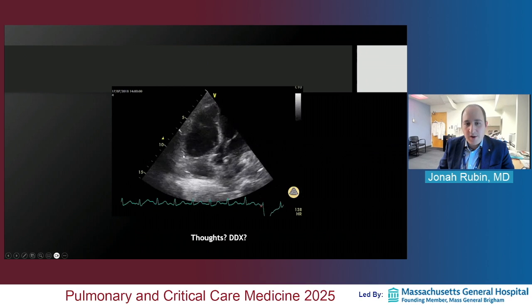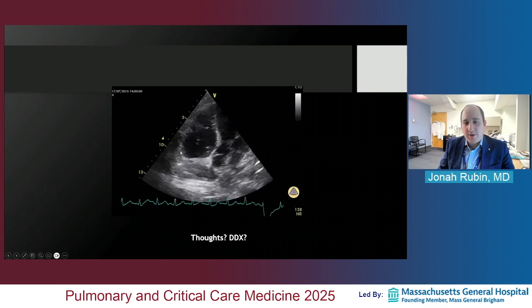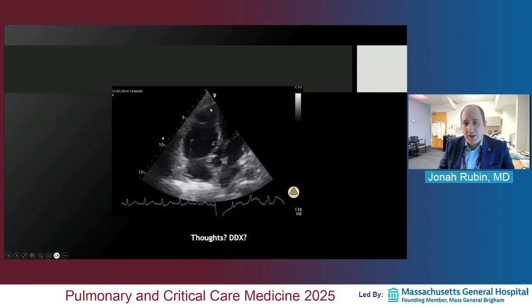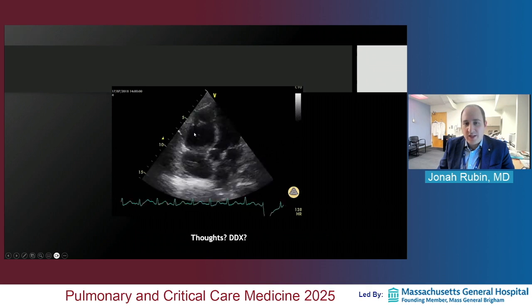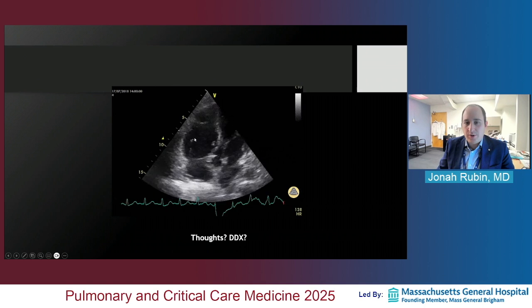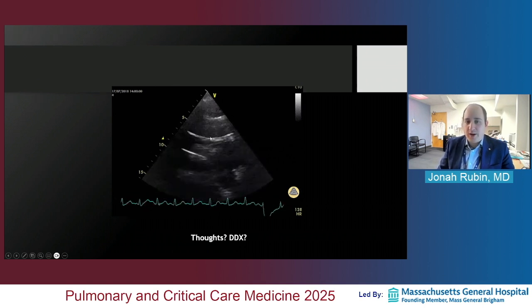And look also at that longitudinal function, especially at the annulus, which when we measure it we call TAPSE. But even if you just eyeball it, it doesn't look terrible. And the apex here is actually invaginating too. But if you look for that chamber contractility, that bellows, there's very little change in the area of the ventricle, presumably demonstrating very poor cardiac output from the right side.